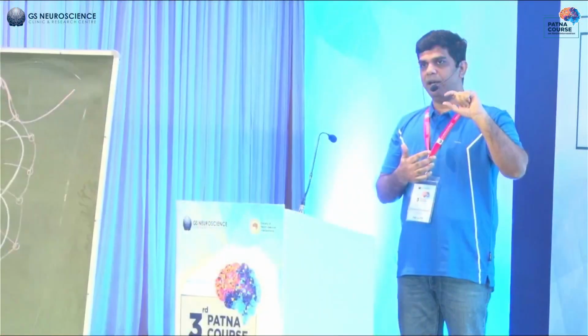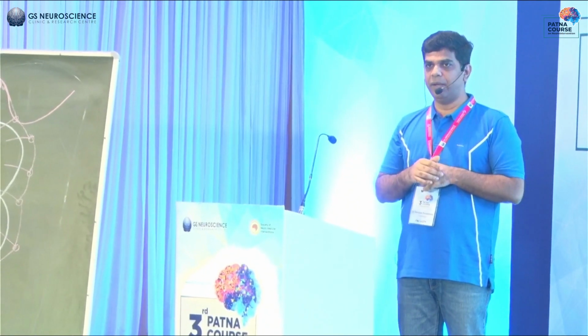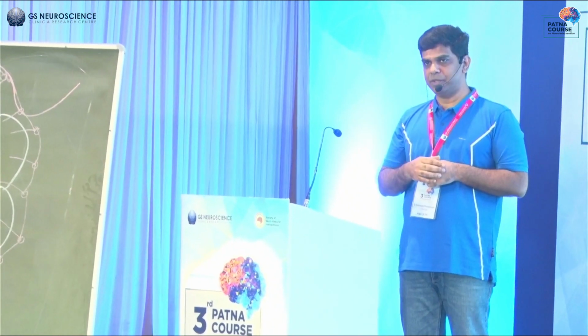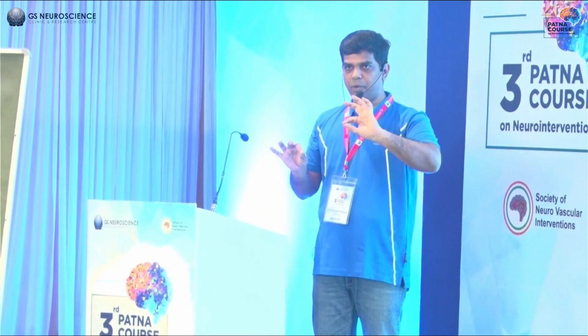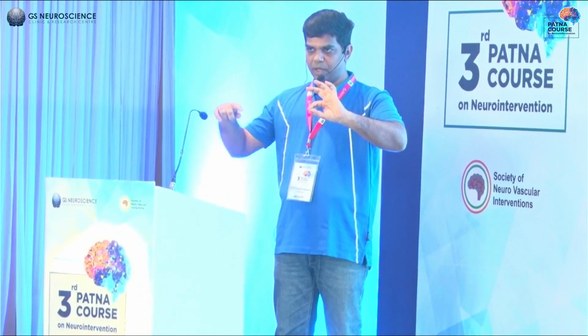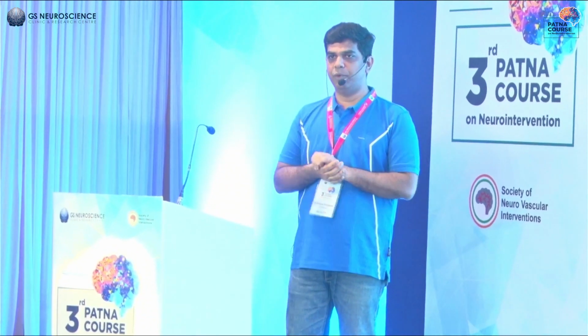And as we told, the accordion technique with the micro wire, the 007 wire. Nowadays, I use the Hybrid 007, and you use it as an accordion, not really putting it distal to the catheter. Keep it within the catheter, keep pushing forward on the catheter, and just move your micro wire back and forth on the curve. Most of the time, it will push your microcatheter more distally.